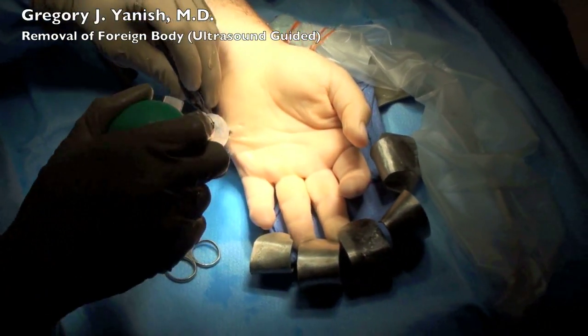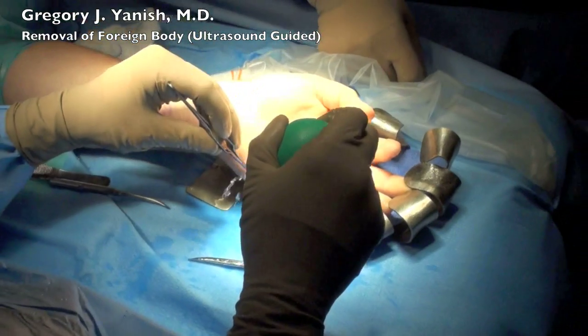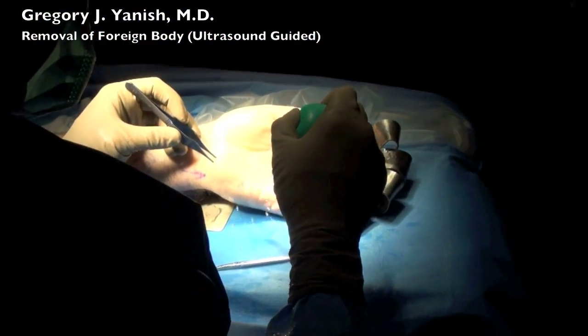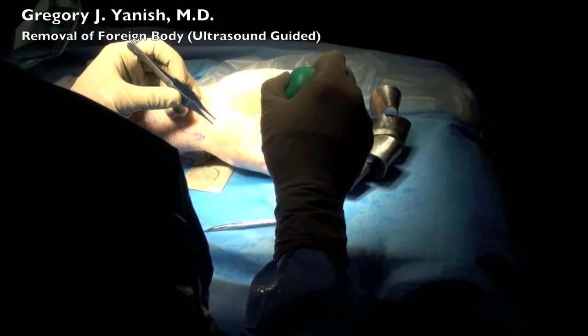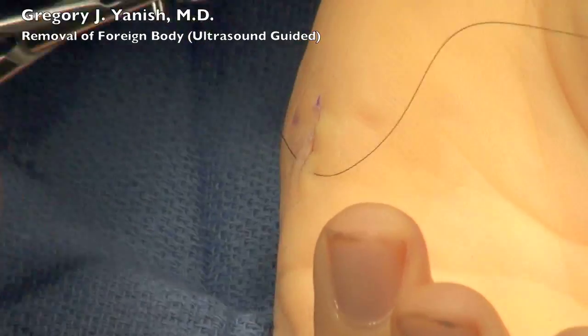In the operating room, we then took another x-ray and took a second look with ultrasound to make sure that all fragments had been retrieved, which they were. And then the wound was sutured closed once again.